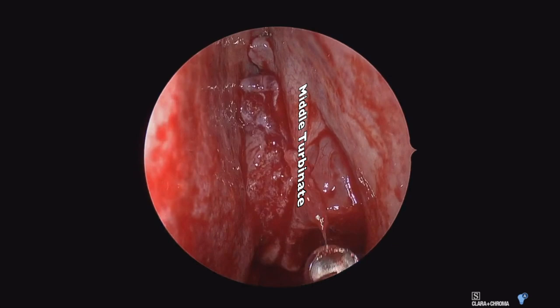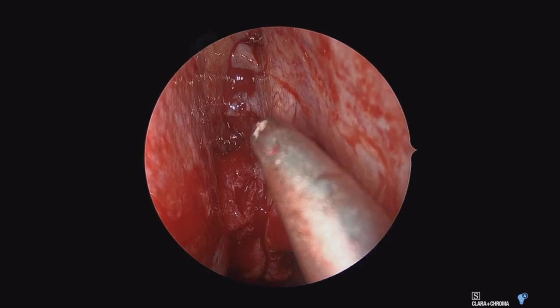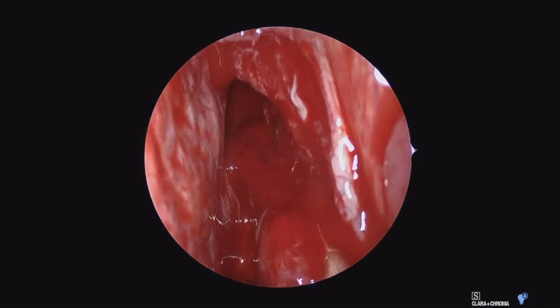We're now tracking the tumor up onto the nasal septum in the area of the patient's middle turbinate. Because the bifrontal craniotomy has already been completed, we'll be able to access that area readily and see that in short order.